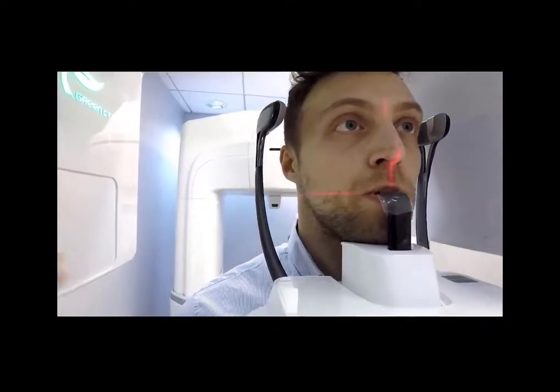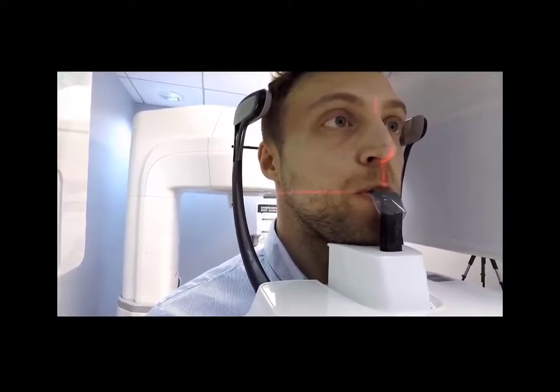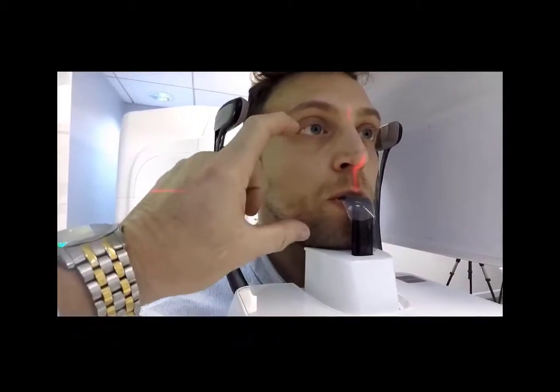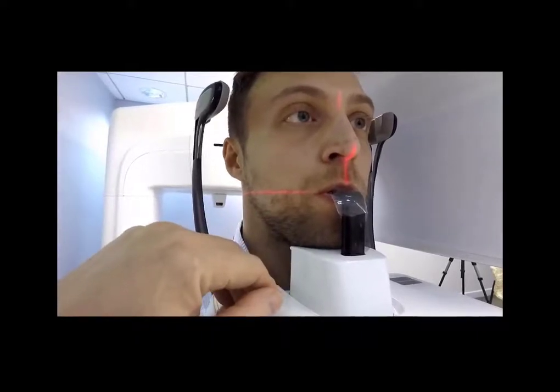Okay. The greatest confusion I run into is this horizontal light here. This light here is a reference to verify we're doing a dual arch scan. So in case of doing either an 18 by 10 or 16 by 9 or 12 by 9 and so forth, as part of a dual arch scan, this light here is a reference to identify the fact that we're doing a dual arch. Notice how in this case, it's near the corner of the commissure of his lip itself.